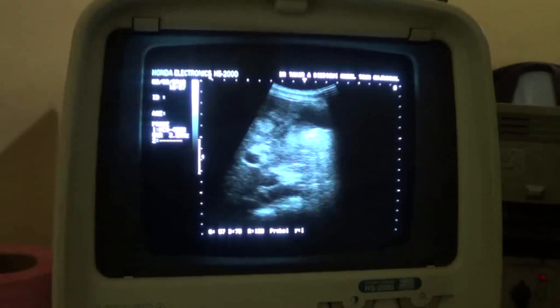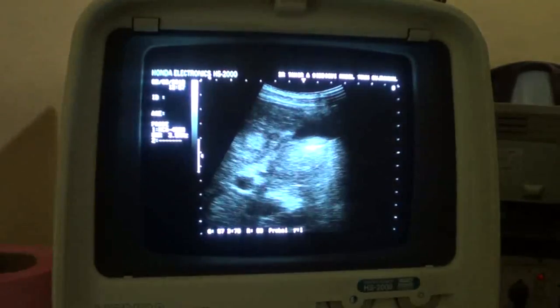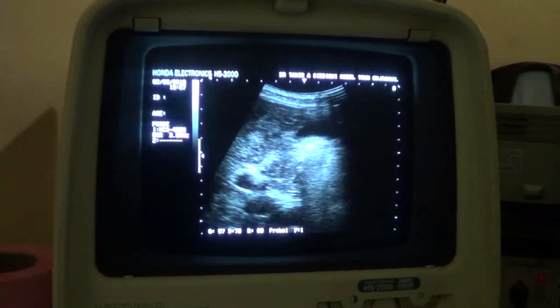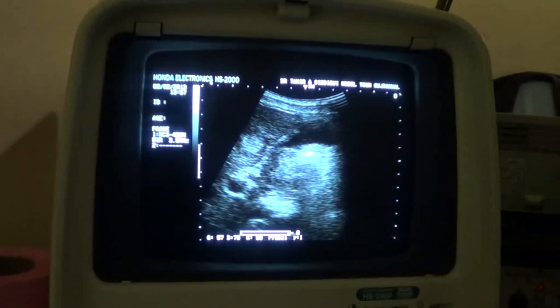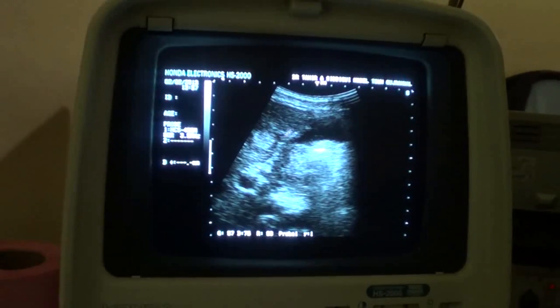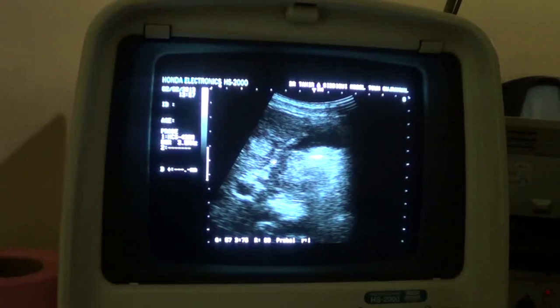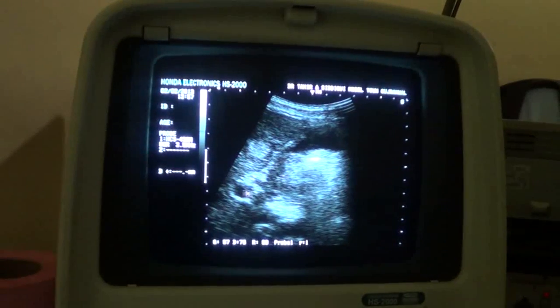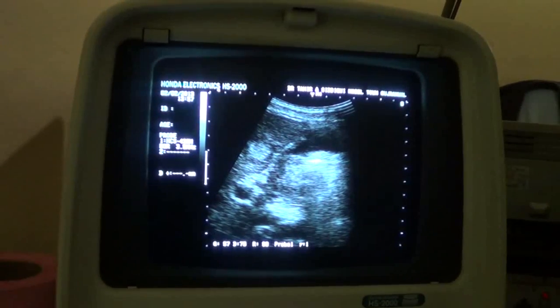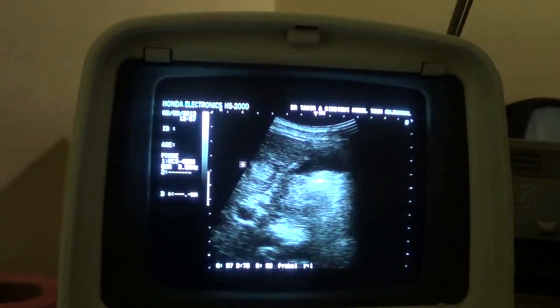Now this is the gallbladder. And we see this is the portal vein and this is the gallbladder. And why is it gallbladder? Because we can see that the portal vein is at right angle to the neck of the gallbladder. Gallbladder is normal and clear. This is the focal lesion.